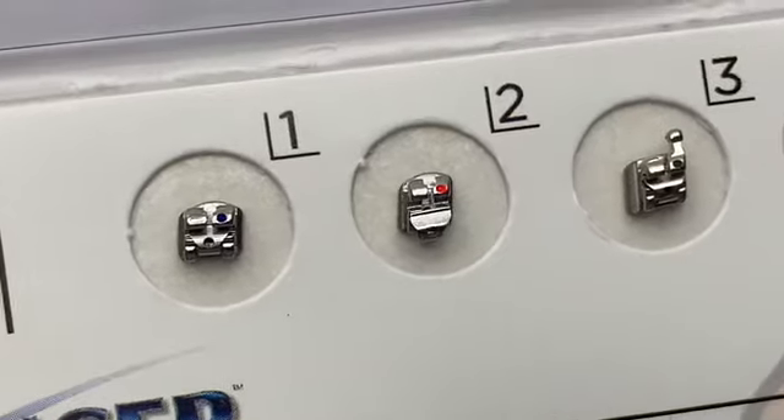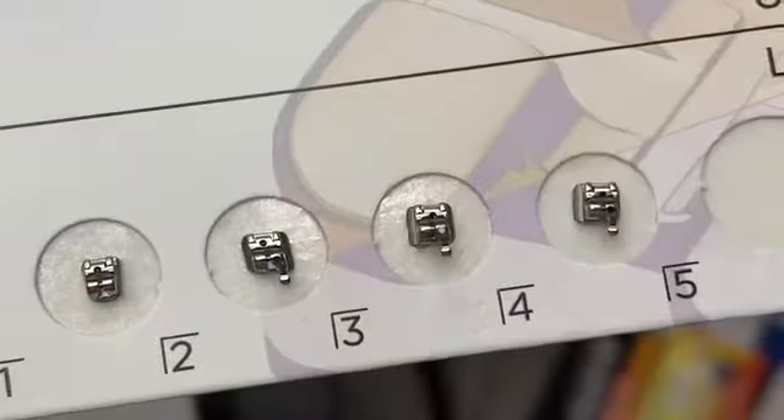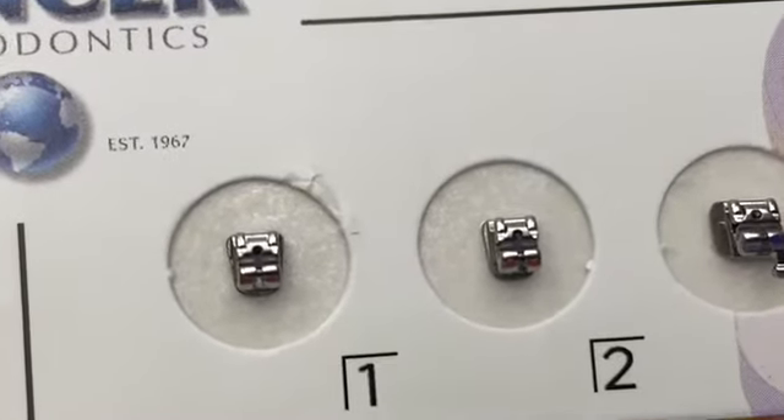The color of black, red, green — those are just color indications of right or left side. Check out the lower anterior. Really small.